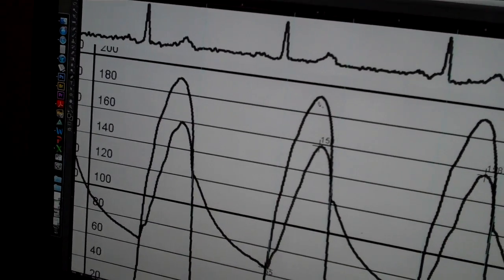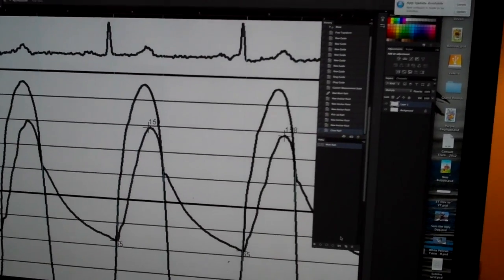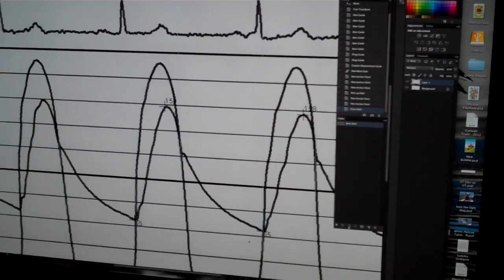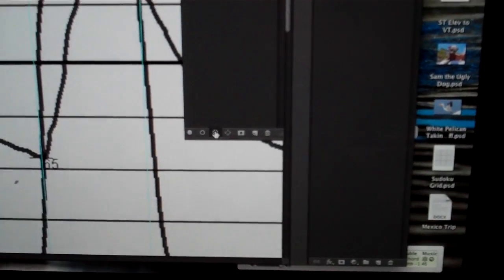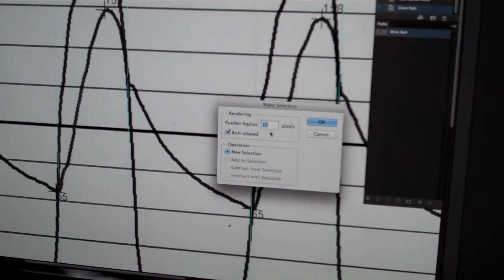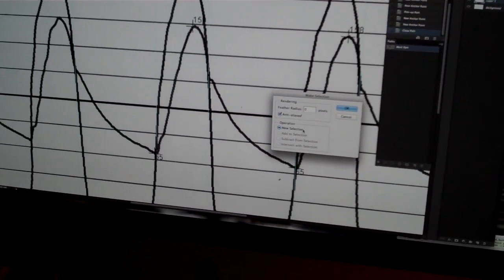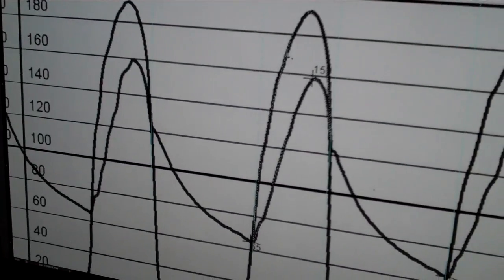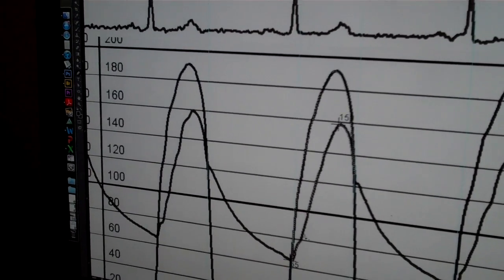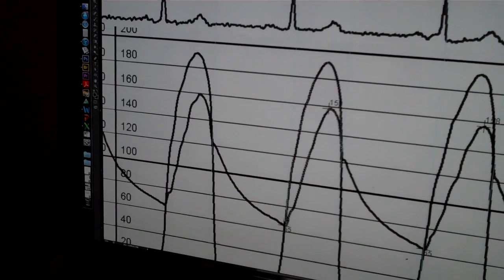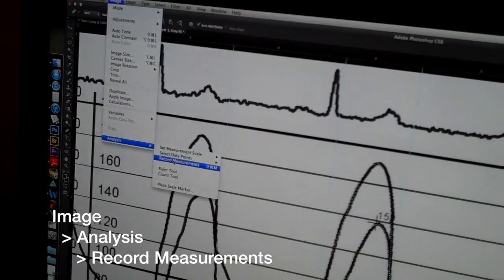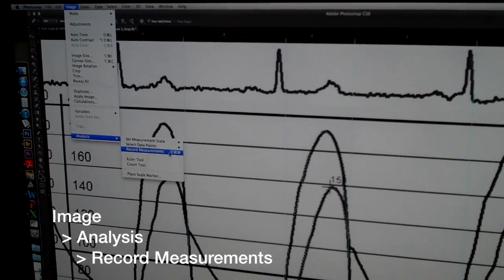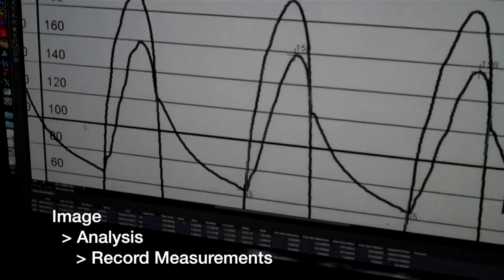Go to the pen tool and I'm going to make a clockwise drawing around this beat. Now this is not going to be an instruction as to how to use the pen tool. There are plenty of tutorials online about how to use the pen tool. Basically I'm making an outline between these two drawings here. Now once I have that completed, I'll go over here to the path menu and I'll hold down the option key on the keyboard. And this dotted circle here, I'll click on that. Make sure I don't have any feather radius checked because that will not work on this one. On a feather radius of zero, new selection, OK.